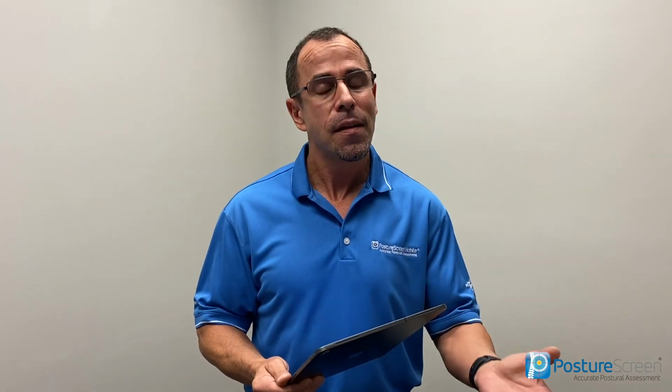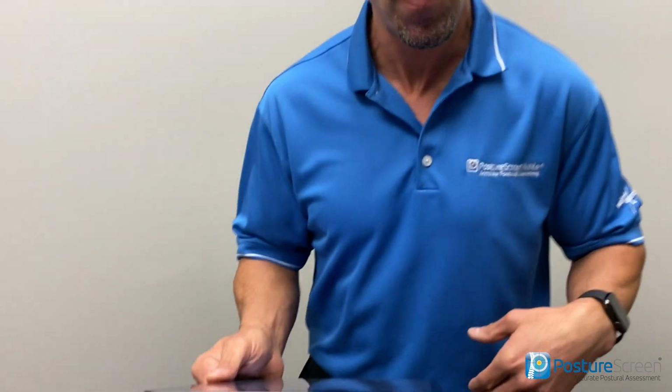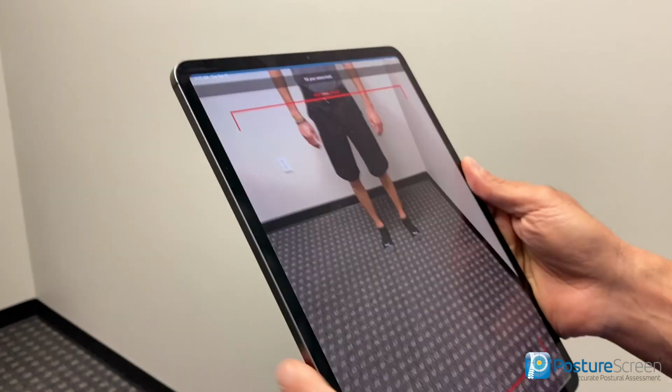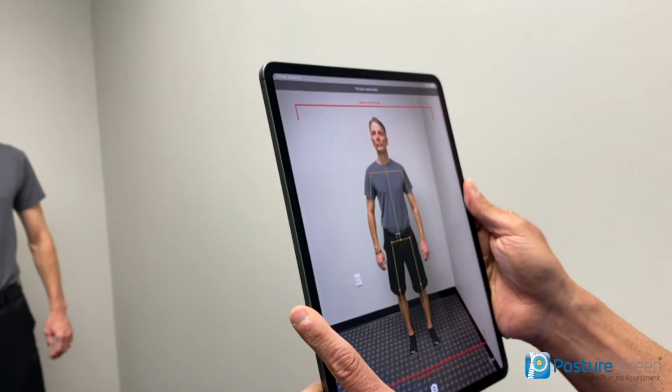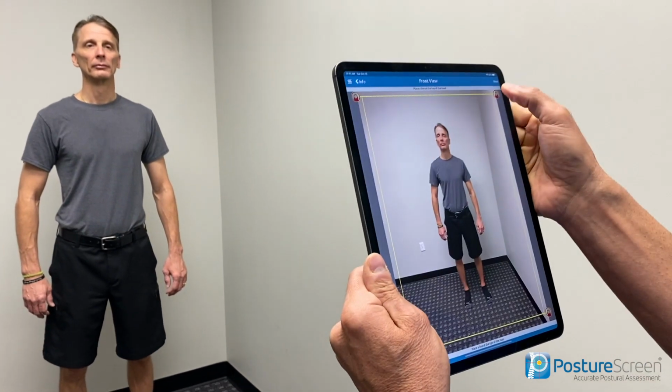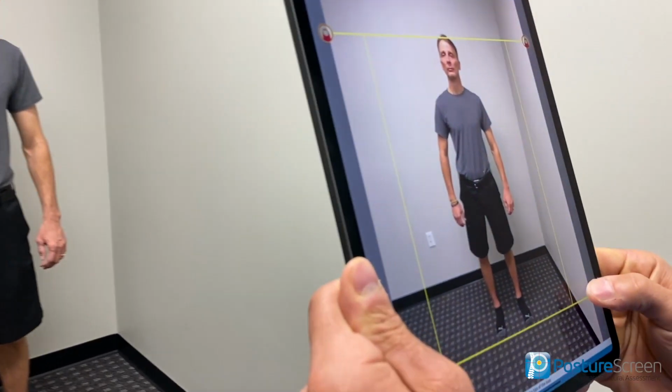Well, anyway, we're gonna go ahead and do this. And as I go, I'm gonna click the approximate anatomy that is not predicted by our algorithms. Over time, that will be done. So let's go ahead, come on over, and let me show you how well this works. We're gonna do the same thing that we did before. We're gonna take a picture, just like I showed before. And then we're gonna scale this.